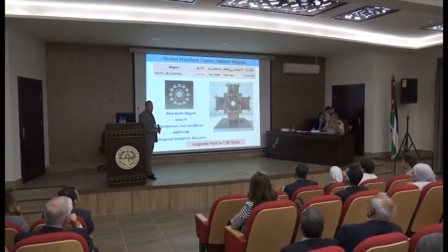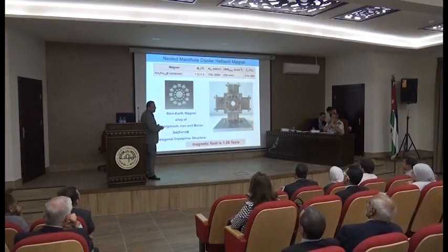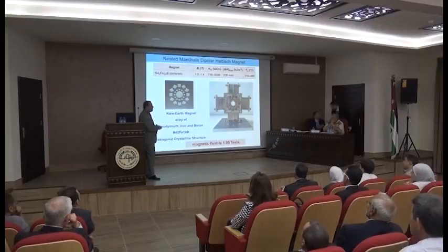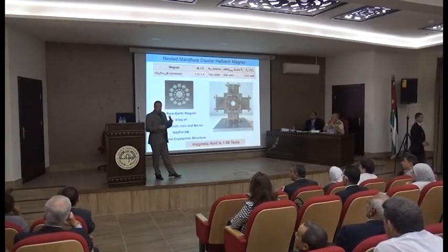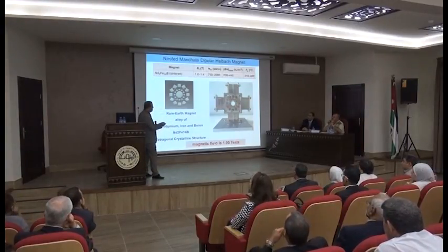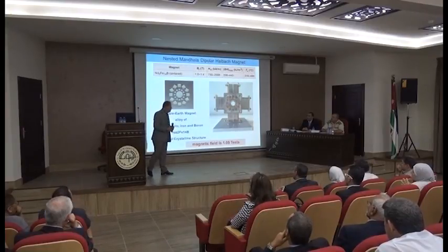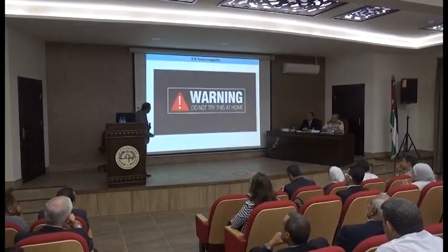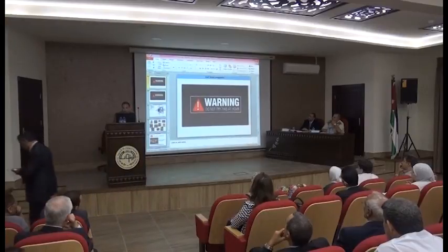This is the magnet. It's almost 25 kilograms, and it's also wide bore. It is seldom to find a wide bore, because people avoid wide bore because of the strength. It goes quadratic. So if you go to a wide bore, then you have a very low magnetic field. But for imaging, we need a high magnetic field. So this is the final product. I have it and it has a magnetic field, and the magnetic field is around 1 Tesla. I don't know if you are familiar with Tesla. For this, I have a video, I hope it will work, to show you how big 1 Tesla is.